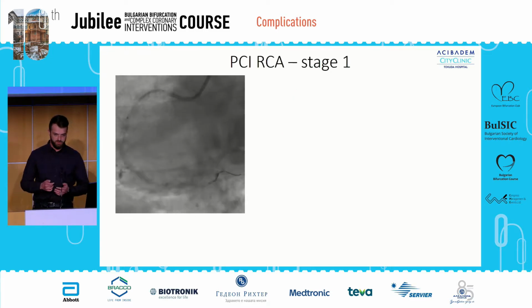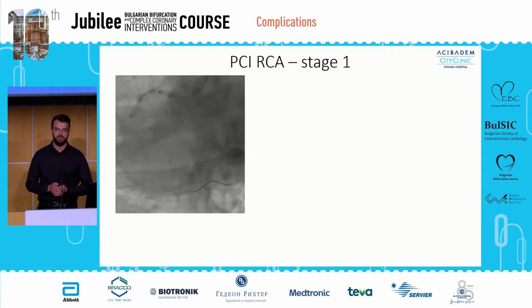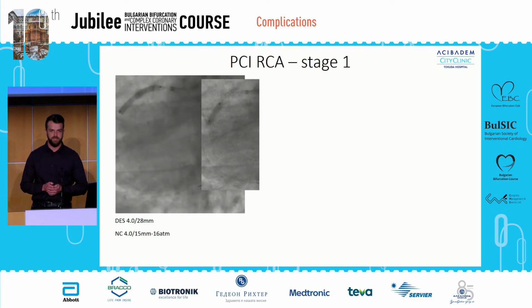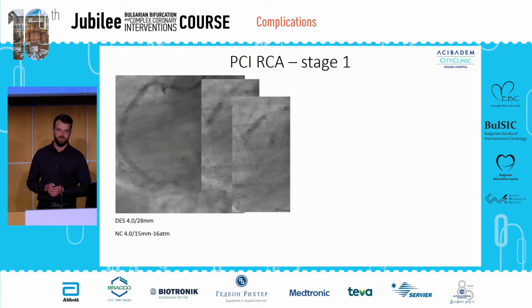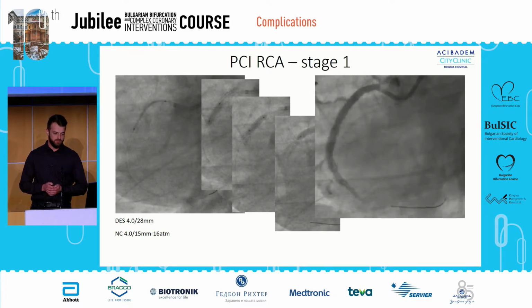We staged the procedure, and we started with the intervention of the right. We chose a 4.0 stent, which was implanted ostially, post-dilated at high pressure with a 4.0 non-compliant balloon, with this final angiographic result.